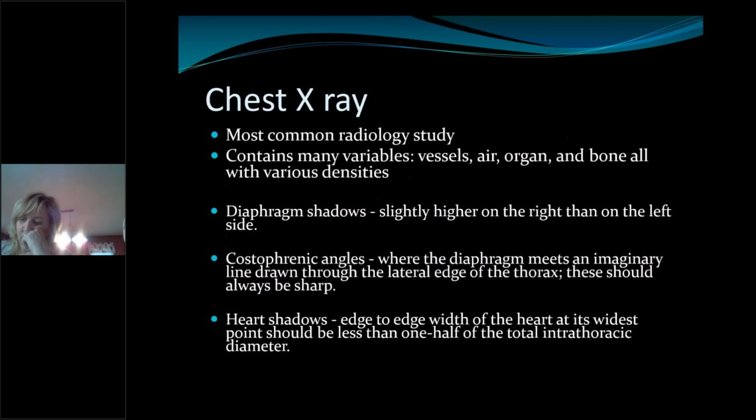So let's start talking about chest x-ray, and we'll get to some pictures here in a little bit, I promise. Chest film, most common radiological study, ordered daily. What makes it so tough is there's a lot of variables. You got blood vessels, air, organ, bone, and they all have different densities.